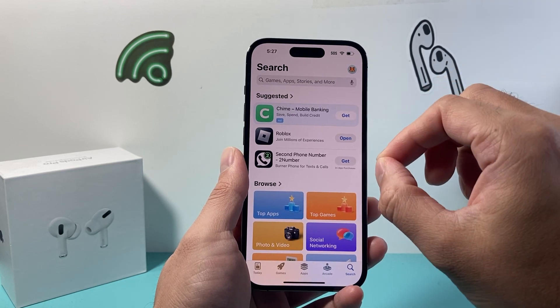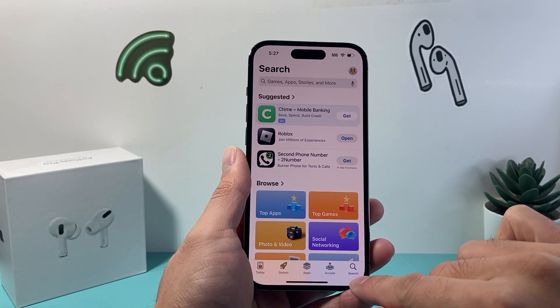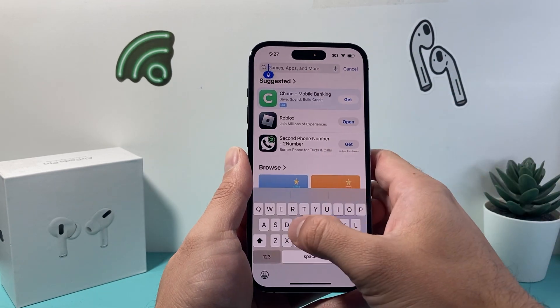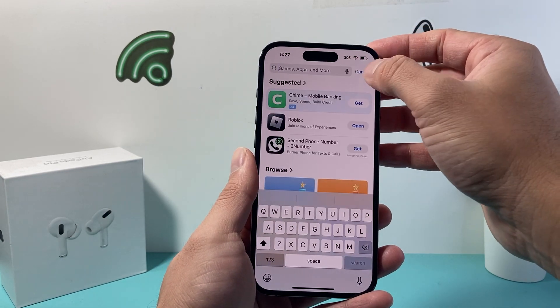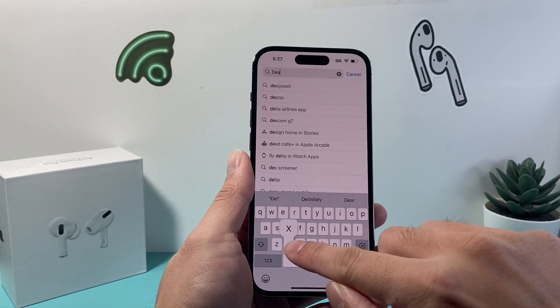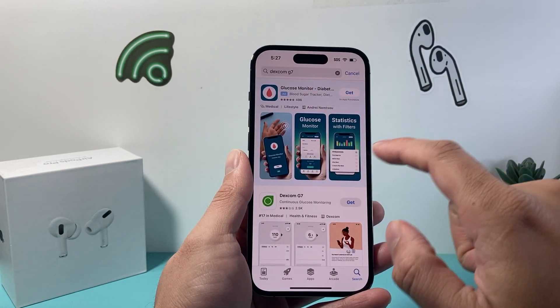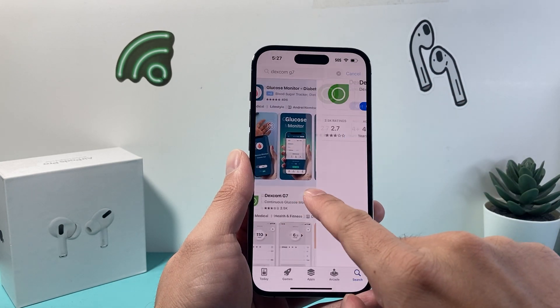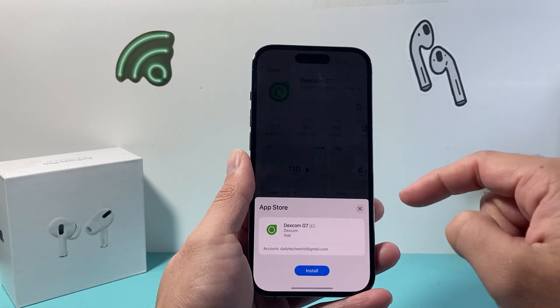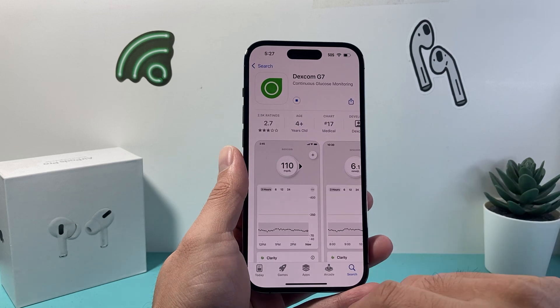Once you have signed in or created an account and you're logged in, go ahead and search for the app by going to the search page. Type in Dexcom G7, or any other Dexcom app. You'll see it right there — tap on it, click Get, then Install, and it'll go ahead and download and install the app.